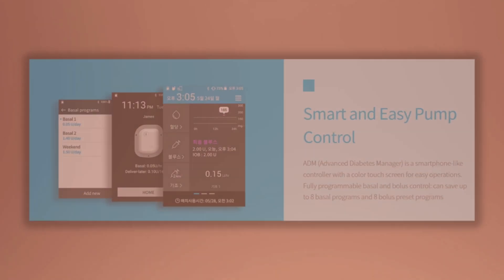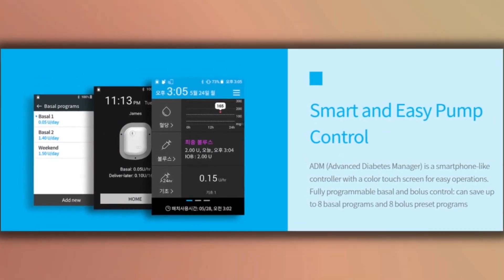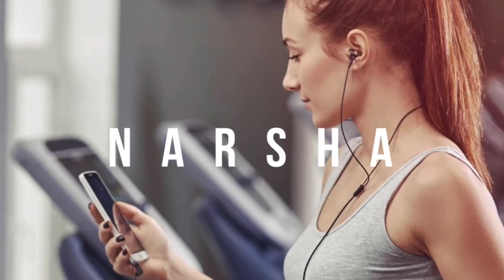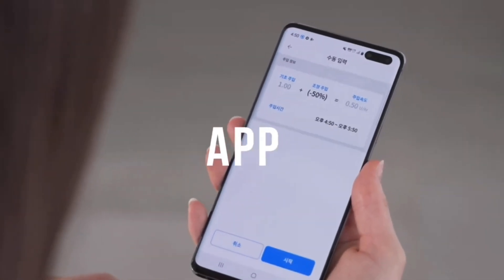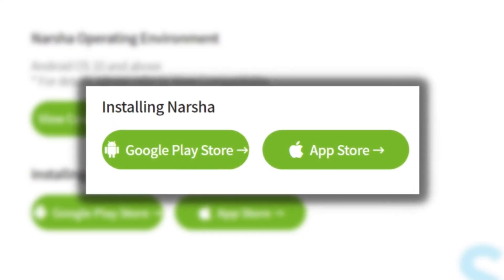It's 110 grams with a 3.5-inch screen, and it has fully programmable basal and bolus control. You can save up to eight basal programs and eight bolus preset programs. The other option, which I'm sure will be more appealing to most people, is using a smartphone application named Narsha. Narsha is a smartphone app that allows you to control the EOpatch via Bluetooth.